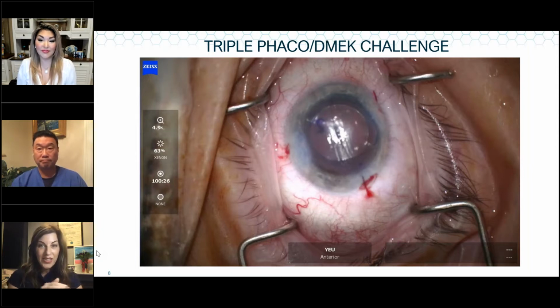Yeah, and then irritating the iris, trying to get it to come down. Right. Tickling it. Yeah, just a little tickle. But this has happened more than once to me. And there was a couple years way back when we were just using epi-Shugarcaine. We weren't even dilating people because we wanted to do things faster. So it is possible to not dilate them at all. But that does make your cataract surgery a little more challenging.